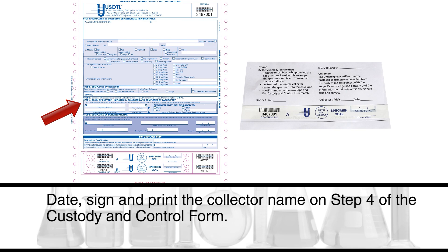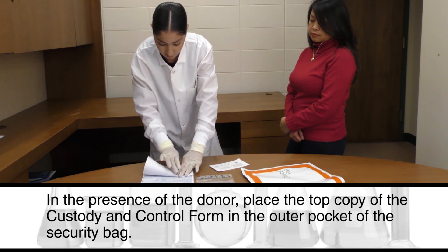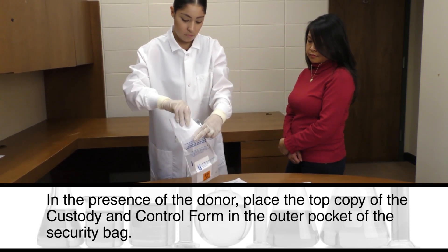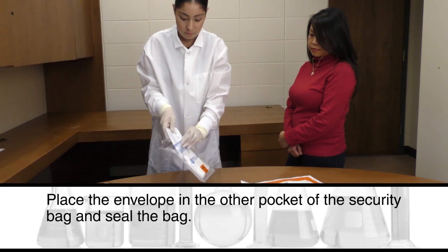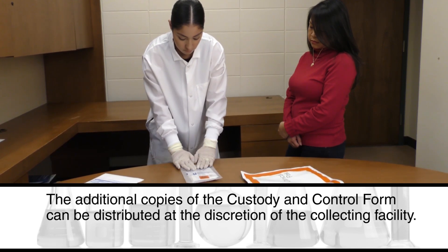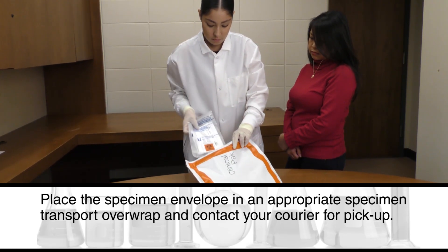Date, sign, and print the collector name in step four of the custody and control form. Have the donor date, print, and sign their name in step five of the custody and control form. In the presence of the donor, place the top copy of the custody and control form in the outer pocket of the security bag. Place the envelope in the other pocket of the security bag and seal the bag. The additional copies of the custody and control form can be distributed at the discretion of the collecting facility. Place the specimen envelope in an appropriate specimen transport over wrap and contact your courier for pickup.